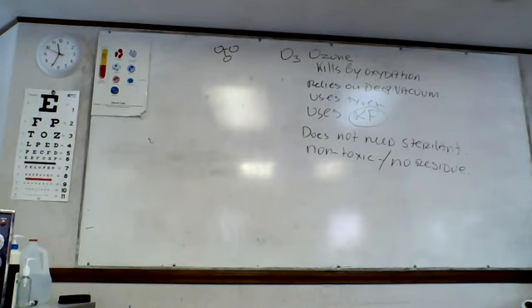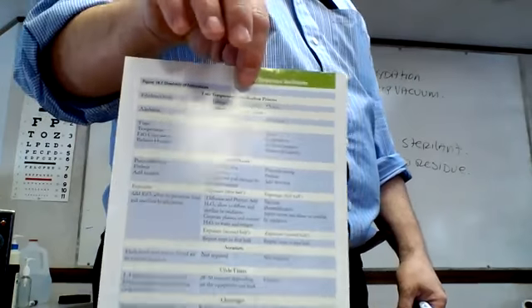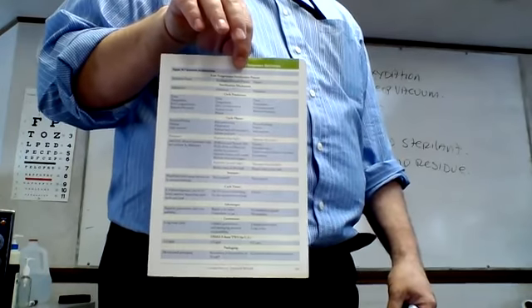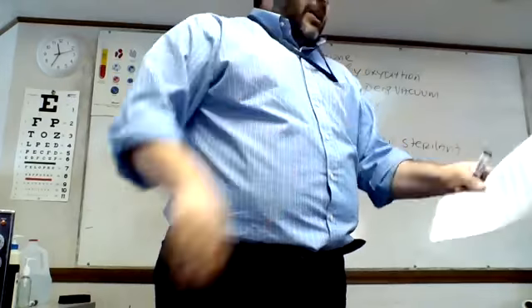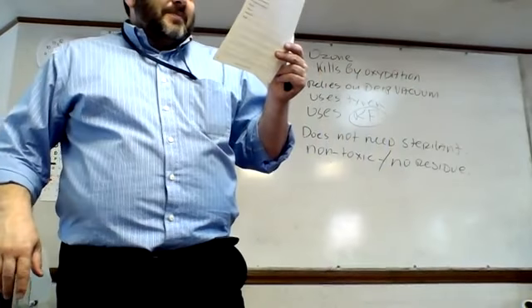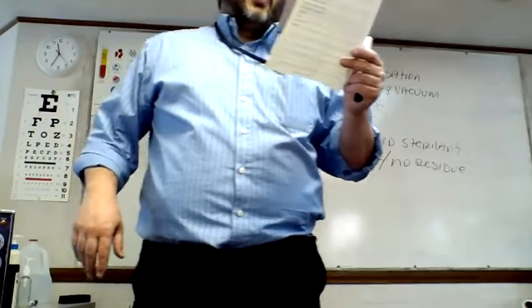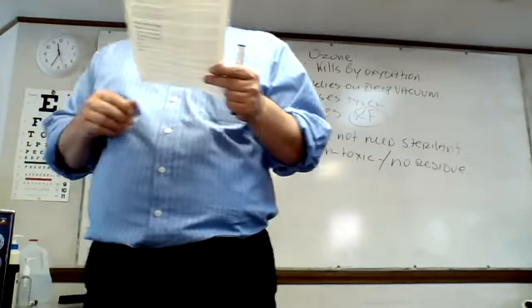340. 341. You are probably right. Yes, indeed, you are correct. Page 341. If you're going to review anything on low temperature sterilization, please make it page 341. That's where we have the table that tells us everything and anything you need to know about all these things. So everything we talked about is on page 341.